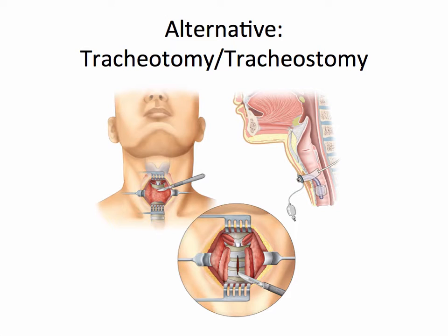An incision is made over the trachea and tissue, and the thyroid is dissected. Another incision is made through the second, third, and fourth tracheal rings. The tracheostomy tube is then inserted into the incision site and supported with a securement device.